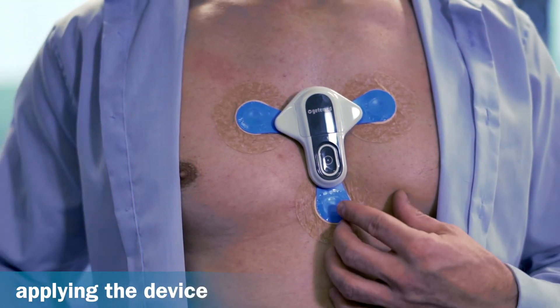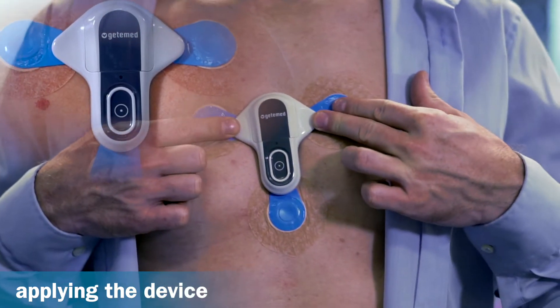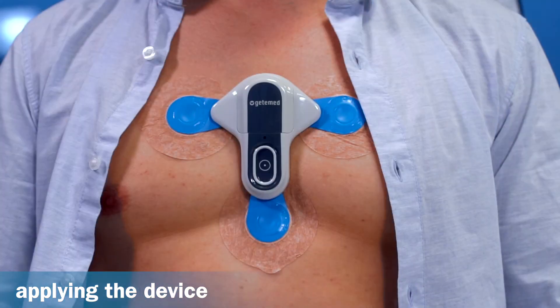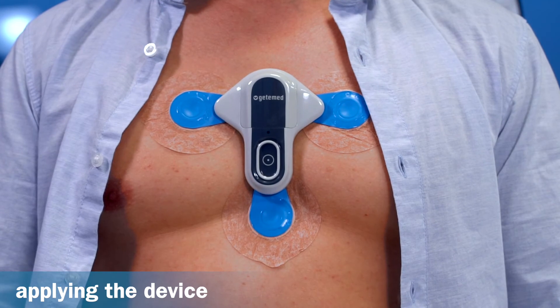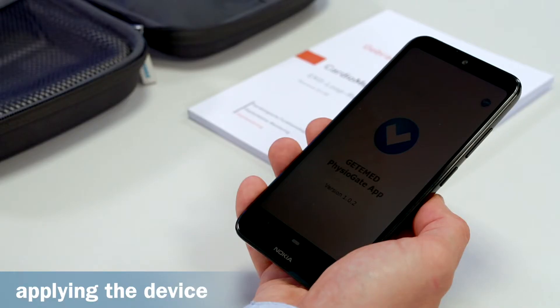If the signal quality is poor and the recorder detects that an electrode has become loose, the light indicator flashes orange. In this case, the recorder is not ready for operation. To record an event manually, simply press the button. After releasing it, a short beep sounds, informing you that the event is being recorded. Once the recording is finished, it will be transferred to your smartphone and then transmitted to your doctor or service centre.